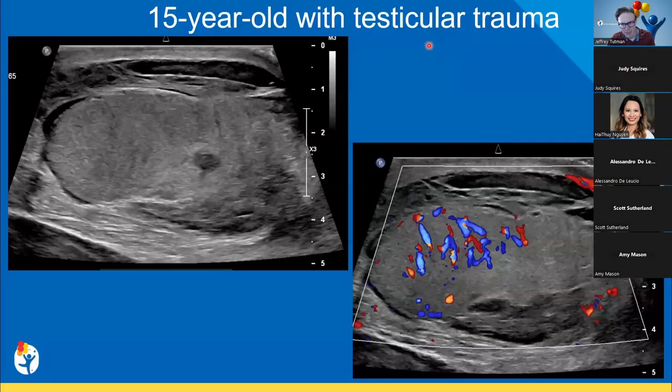Right. And then again, changing gears, talking a little bit about trauma. So this is a 15-year-old who came in with testicular trauma. I think this is a couple of cases I'll show you here, mainly to make the distinction in our terminology and how we think about these cases.